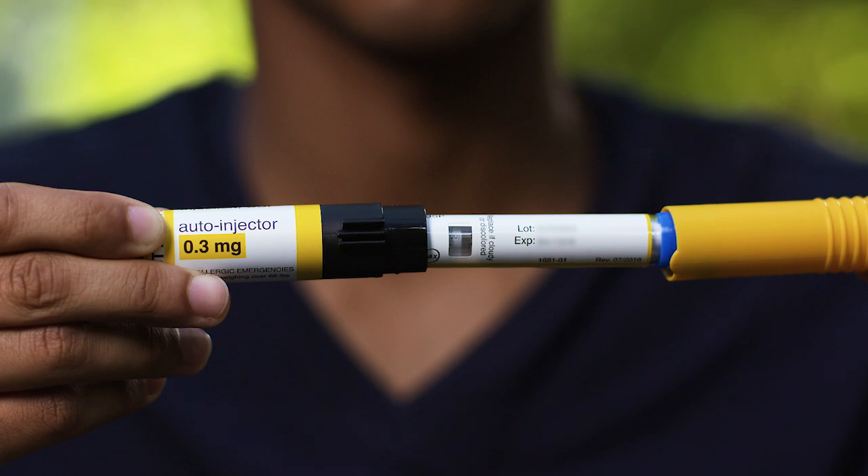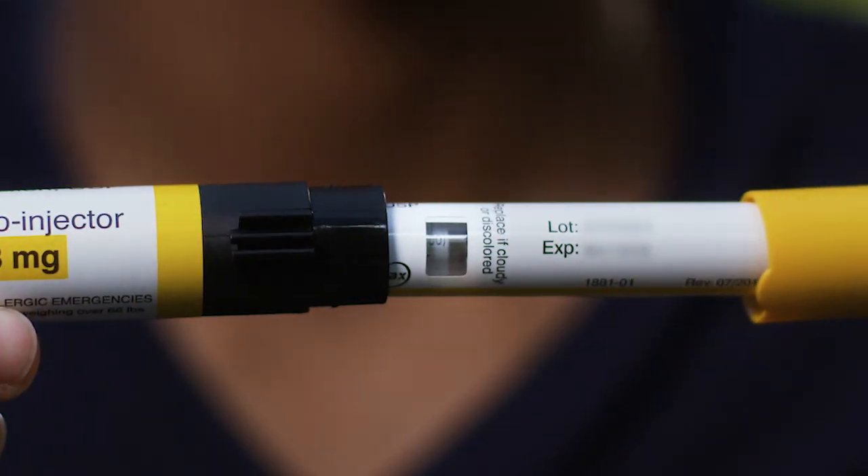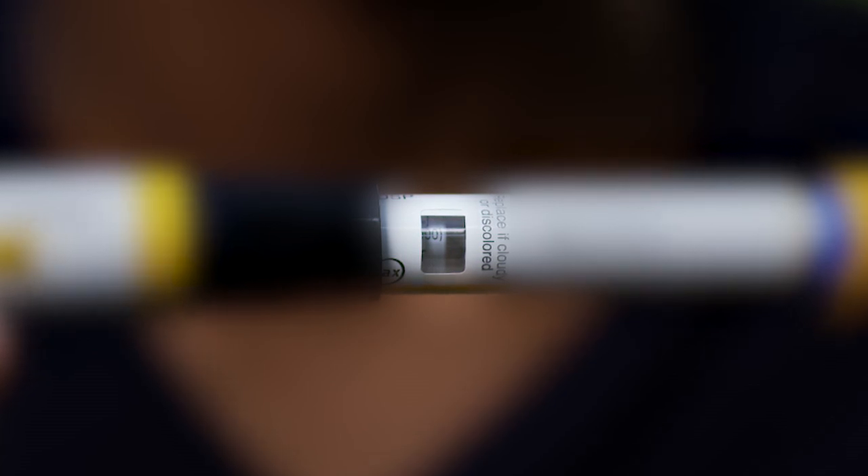You should be regularly checking the medicine through the viewing window. If it looks cloudy or discolored, or has any particles in it, or if the expiration date has passed, the auto-injector should be replaced.